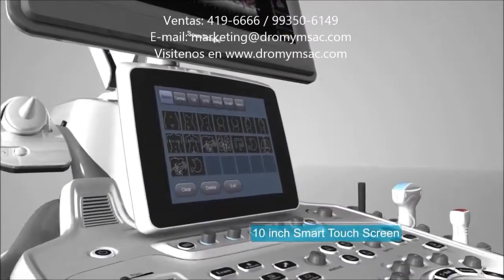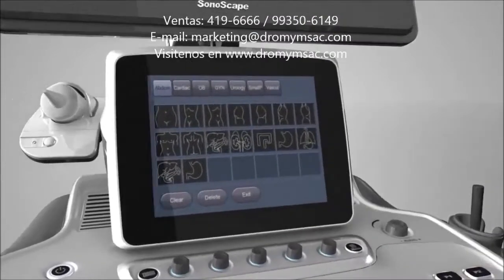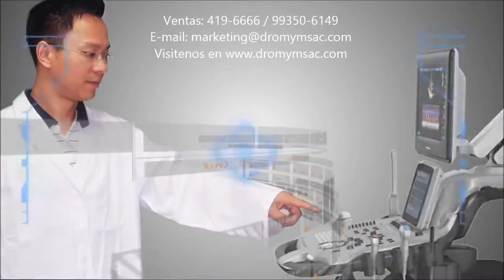S40 features a 10-inch, high-definition, intelligent, capacitive touchscreen. It is adjustable, anti-fingerprint, and scratch-resistant with high hardening.